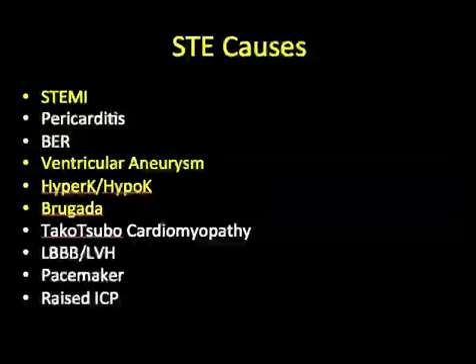Now just a quick note here about the cause of ST elevation. The causes of ST elevation can be many. ST can go up because of a whole lot of reasons. A common one is STEMI. You need to know the other causes also, because it is important for us to understand every ST elevation does not represent acute coronary syndrome. Your history is very important.